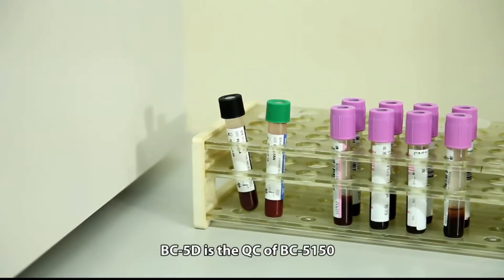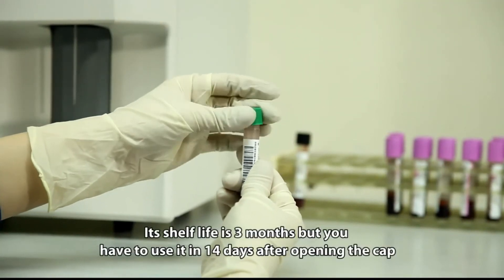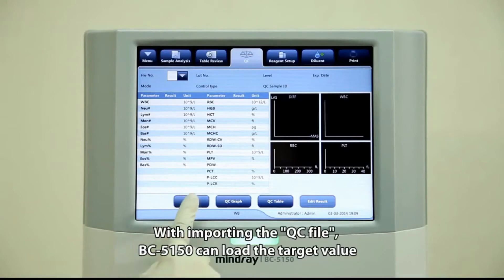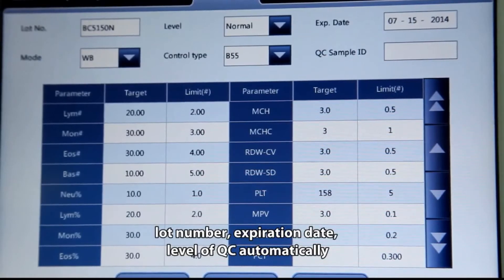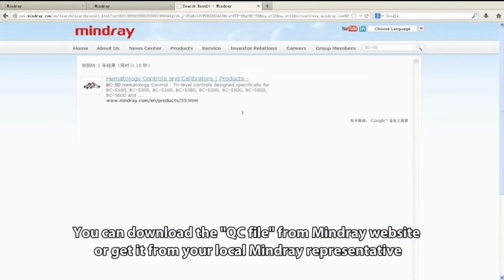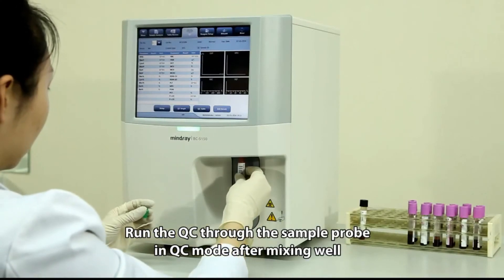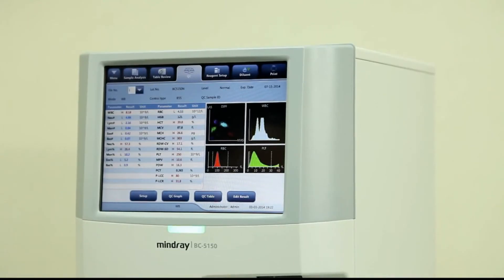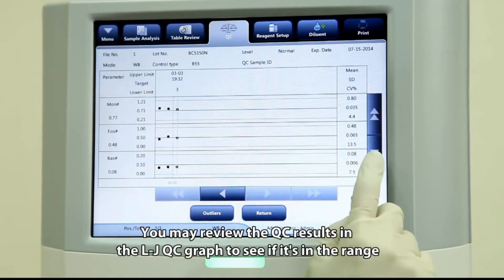BC5D is the QC material for BC5150. Its shelf life is three months, but it must be used within 14 days after opening the cap. By importing the QC file, BC5150 can automatically load the target value, lot number, expiration date, and QC level. You can download the QC file from the Mindray website or obtain it from your local Mindray representative. Run the QC through the sample probe in QC mode after mixing well. You may review QC results in the LJ QC graph to verify they are within range.